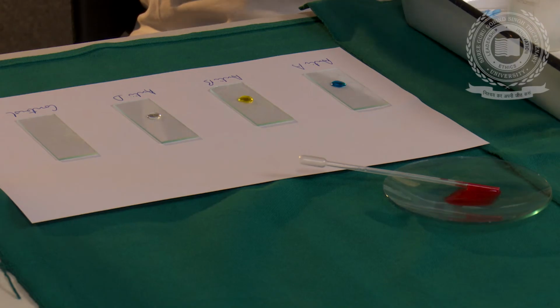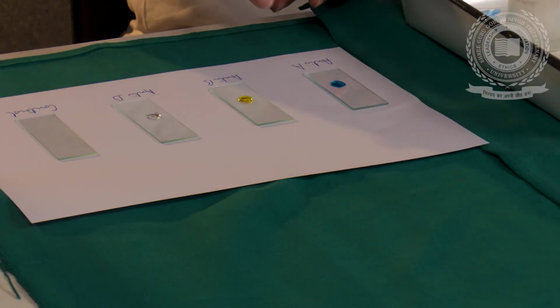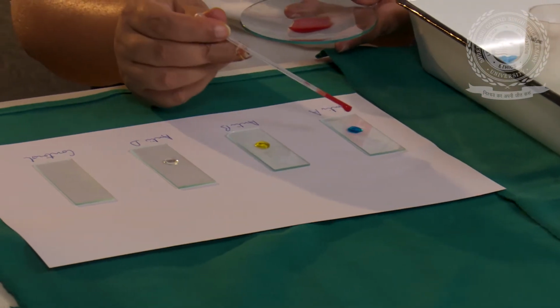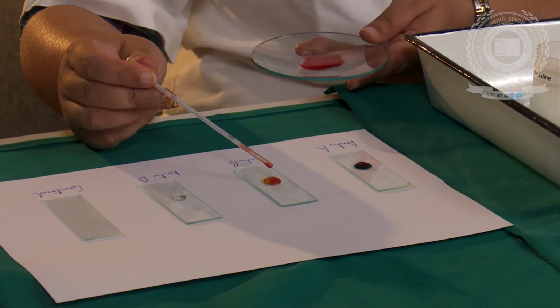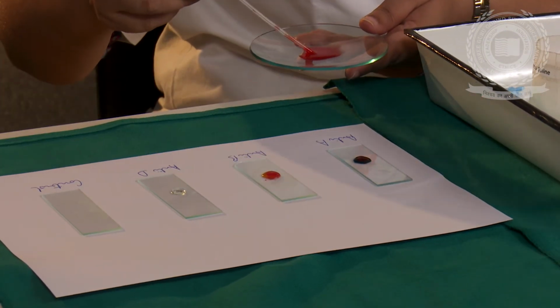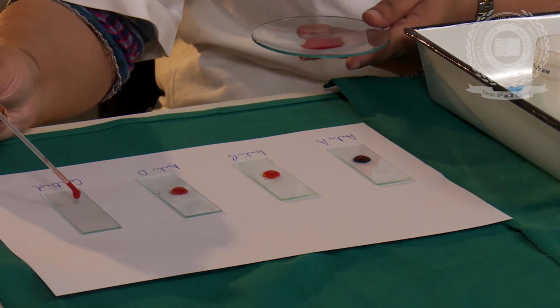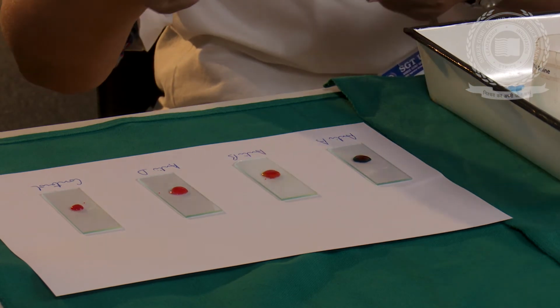Next, we put a drop of the blood saline suspension on top of these drops like this without touching, and only a drop of the saline suspension on the control slide.